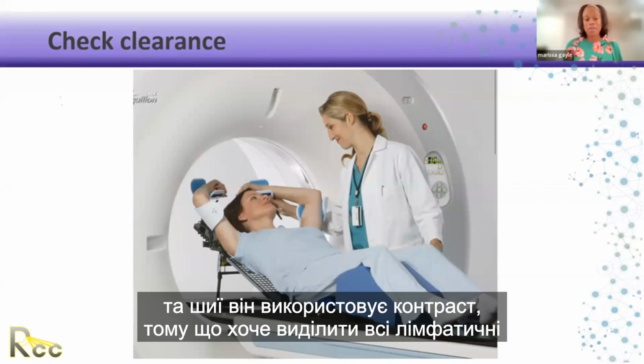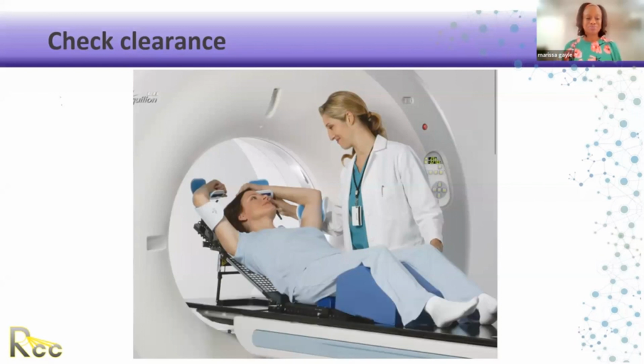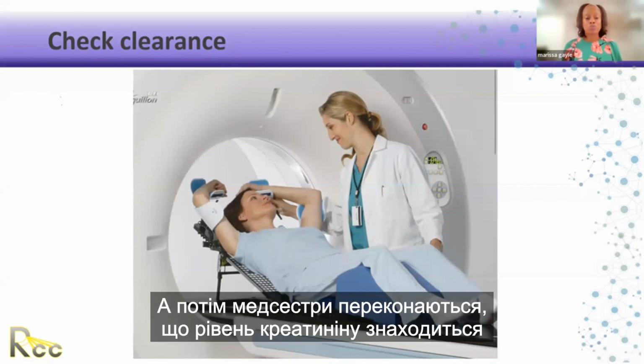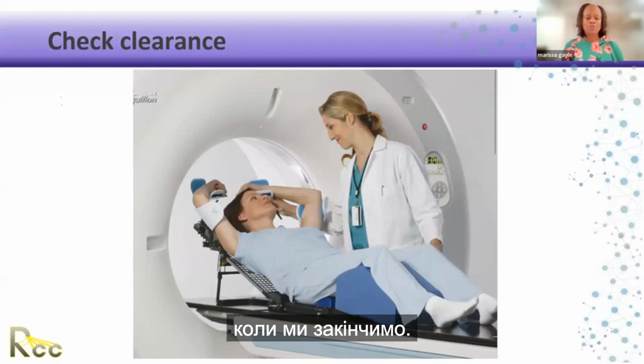For example, for the majority of our head and neck cases, he will use contrast because he wants to highlight all those lymph nodes and critical structures in the head. Then the nurses will make sure that their creatinine level is within range, so that their kidneys can process the contrast when we're done. So that's really doctor dependent.